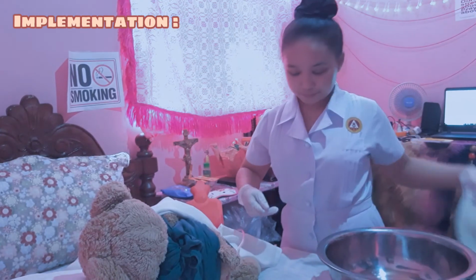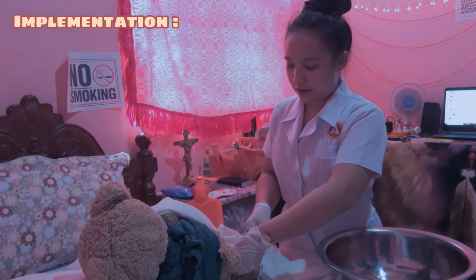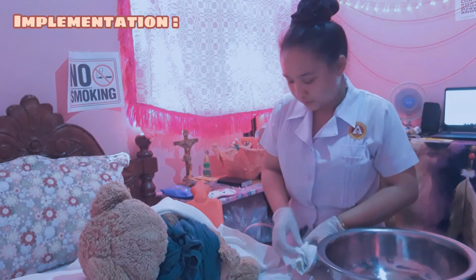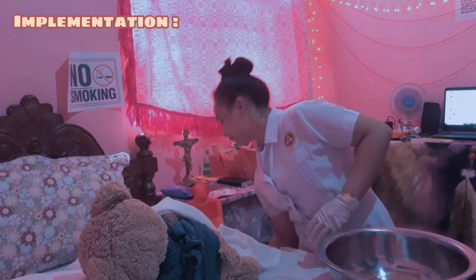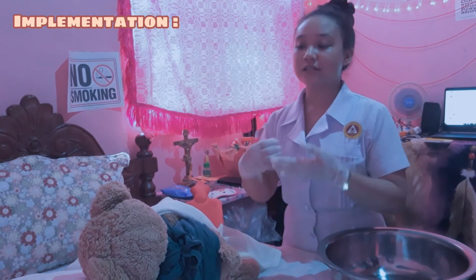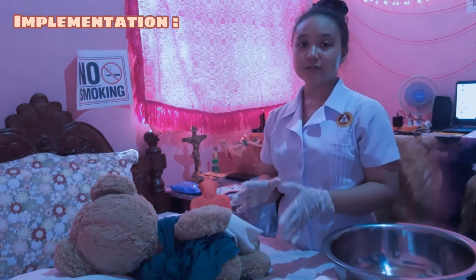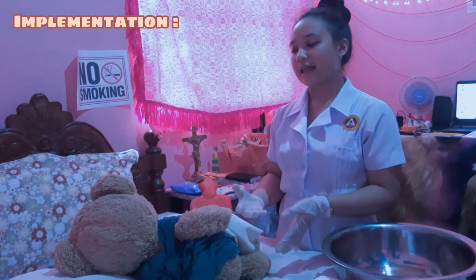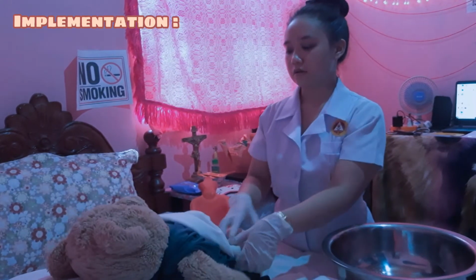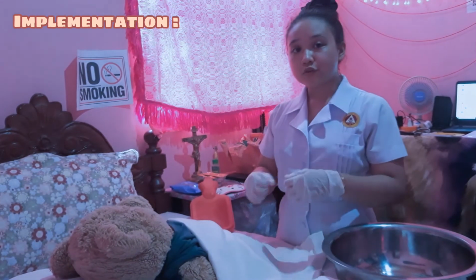So here, I'm going to withdraw it now slowly. Then put it in the towel, and then dispose of it. As you dispose of it, encourage the client to retain the enema. Ask your client to remain lying down, and help him or her be comfortable.